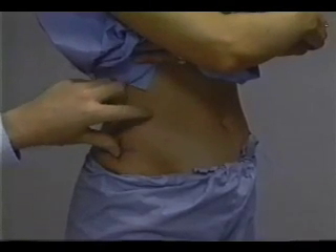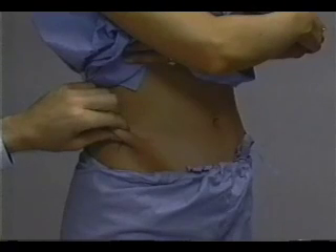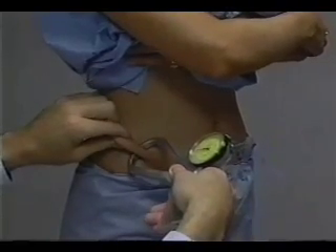The technician's thumb is placed on the intersecting marks, and the index finger is placed above and anterior to the mark. The skin fold slopes downward at approximately a 45-degree angle toward the pubic symphysis. The tips of the caliper jaws are placed approximately two centimeters below the fingertips.